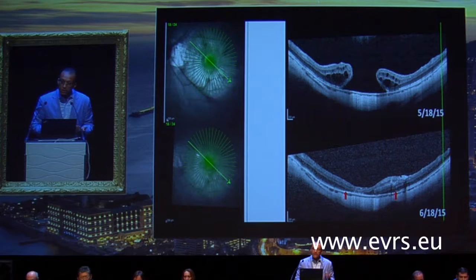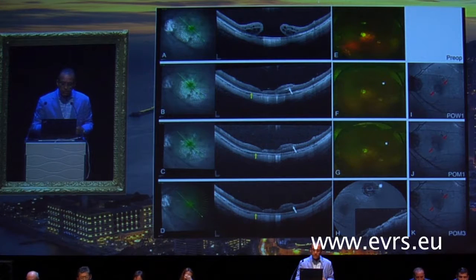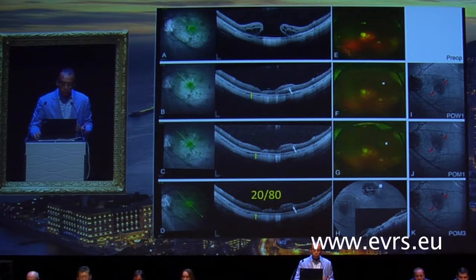So actually, I did not close the hole. The transplant is the one that closed the hole. So when you look at the OCT gradually, you can see the transplant over that area, and it closes the area of the hole. And then gradually, that patient improved to 20/80. Then I started doing microperimetry to try to understand what's happening in that area and the eccentric fixation. And because her vision was improving, I decided to remove the oil.